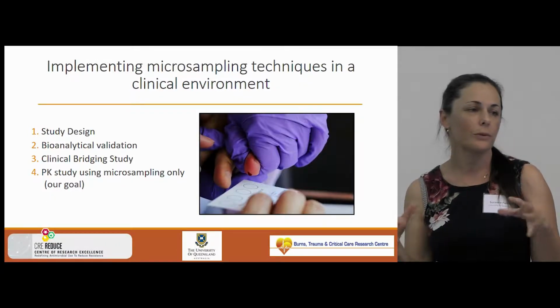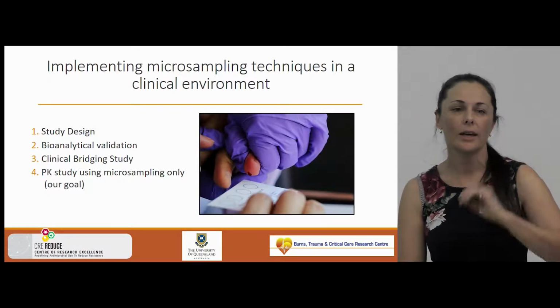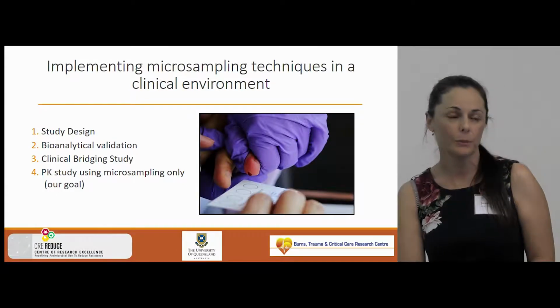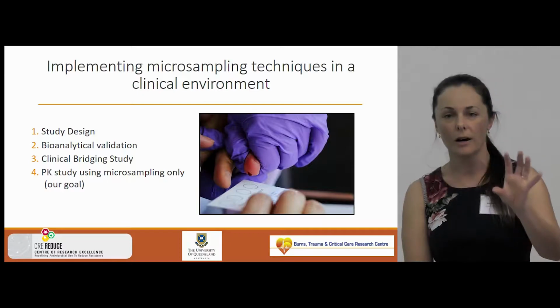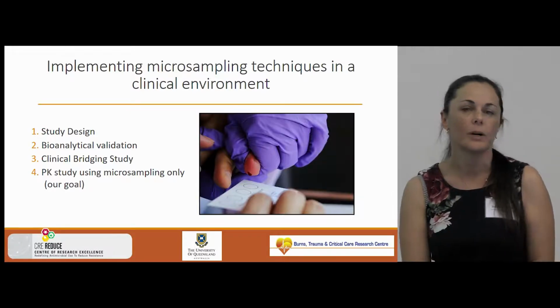They supply us with good detailed testing for our normal clinical samples, where we do traditional sampling and we have a liquid plasma sample. The FDA have also recently provided information for dried blood spot analysis, and we can use this as a bit of a guide of the sort of testing we need to perform when doing our other types of microsamples.